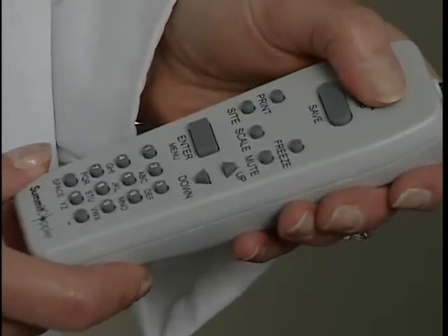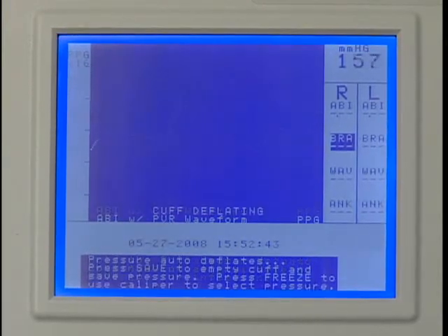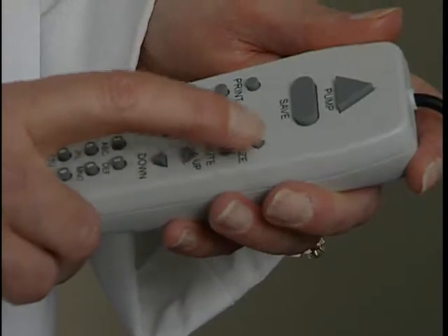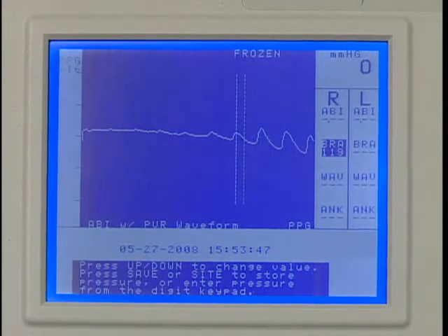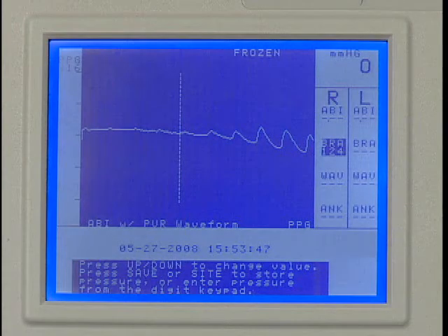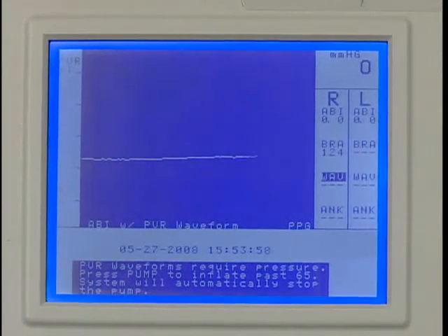Once the waveform is stable, press PUMP to inflate the cuff until the PPG pulsations disappear. Release PUMP and the cuff will begin to deflate. Press FREEZE after several pulses have reappeared. Press the UP or DOWN key to move the caliper tool to the beginning of the first upward slope at the start of the pulsation as shown. This is the systolic pressure. Press SAVE to record the pressure and the marker will move to the next protocol location.